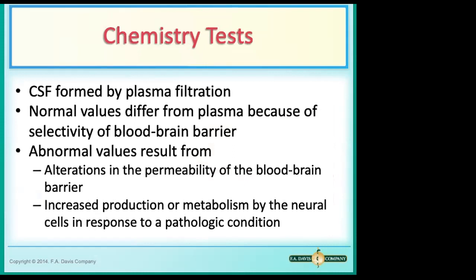So other than the appearance, you're making sure that if it's a bloody specimen, it's not true bleeding. You're also performing the visual inspection of it, the microscopic cell counts. After that, you're doing your differential counts. You're actually identifying the cells.